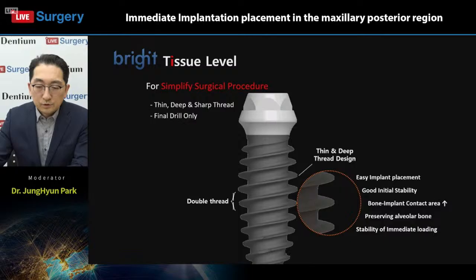In today's live surgery, I will use the bright tissue level fixture. As you may know, this fixture is highly effective for a narrow area. And bright tissue level implants are stronger than internal type implants of the same diameter, allowing the use of thinner fixture.